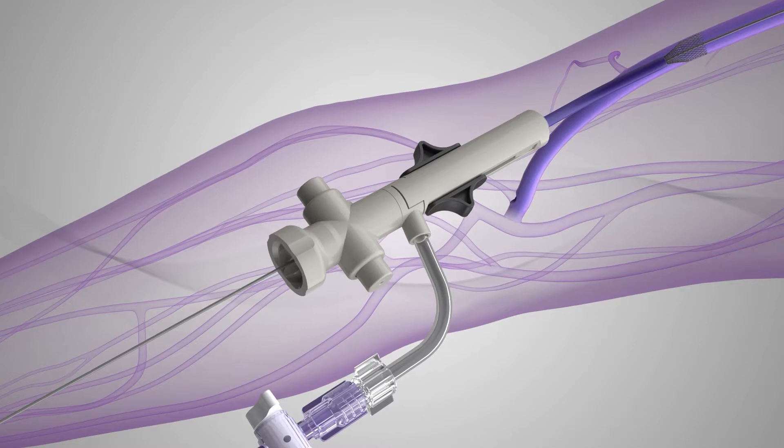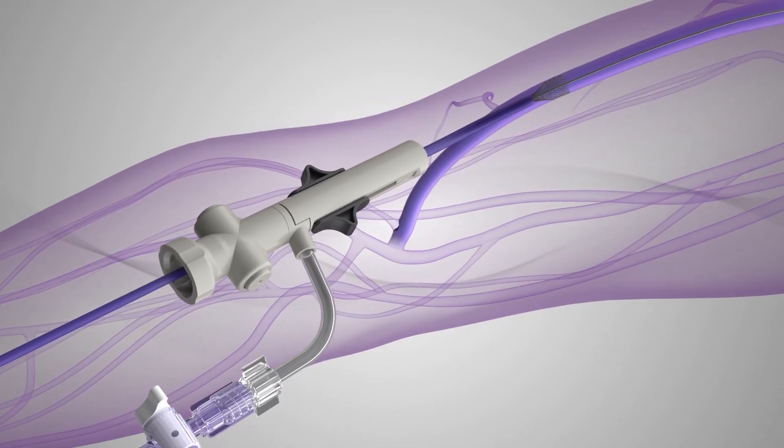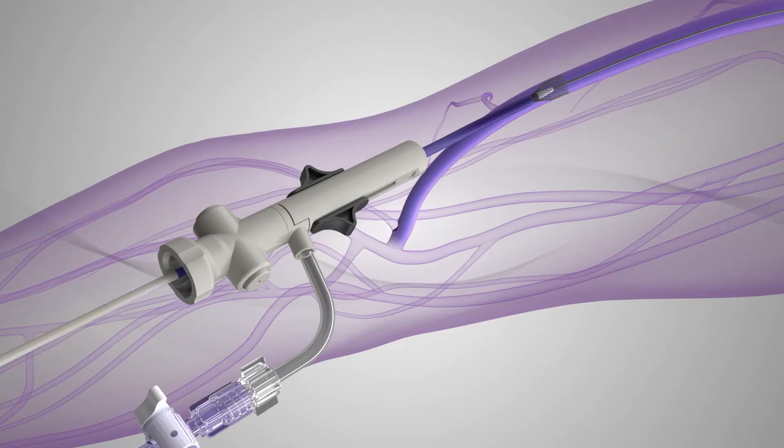With the sheath funnel deployed, the Inthril catheter is introduced over the guide wire and advanced through the sheath's hemostasis valve by pressing the valve buttons. The valve buttons are then released to minimize blood loss.